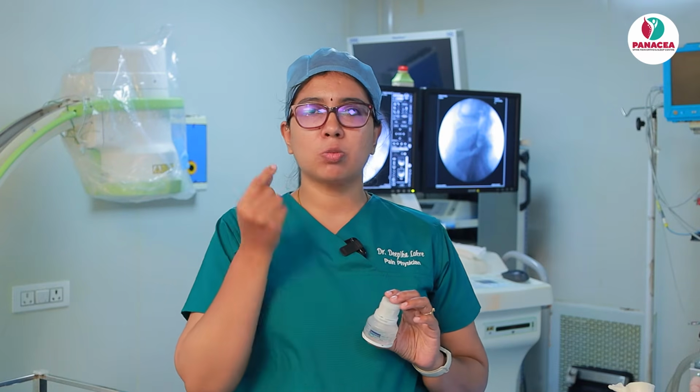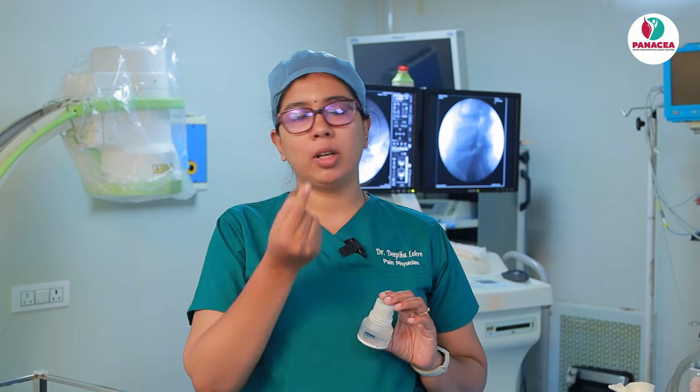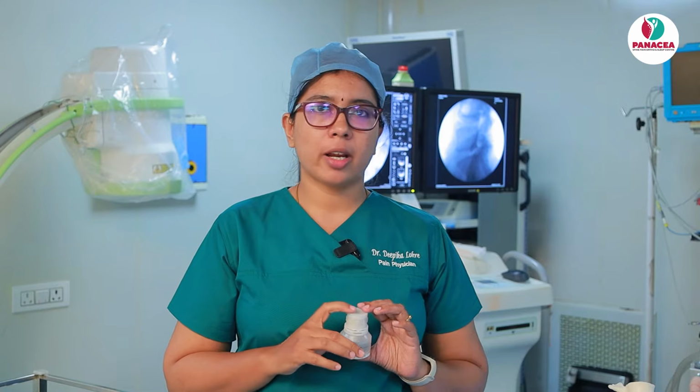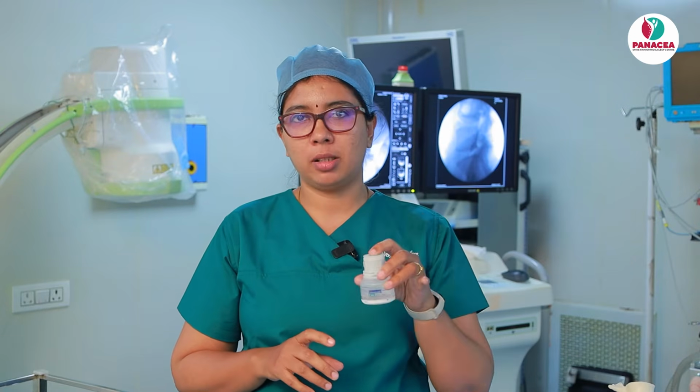It's a very small quantity, so even if the patient is allergic, it is a relative contraindication because we'll be using a very small amount, very unlikely that they will have any allergic reaction to such a small amount. So we are diluting it to 30 to 70%. So 30% of the dye, 70% of saline.